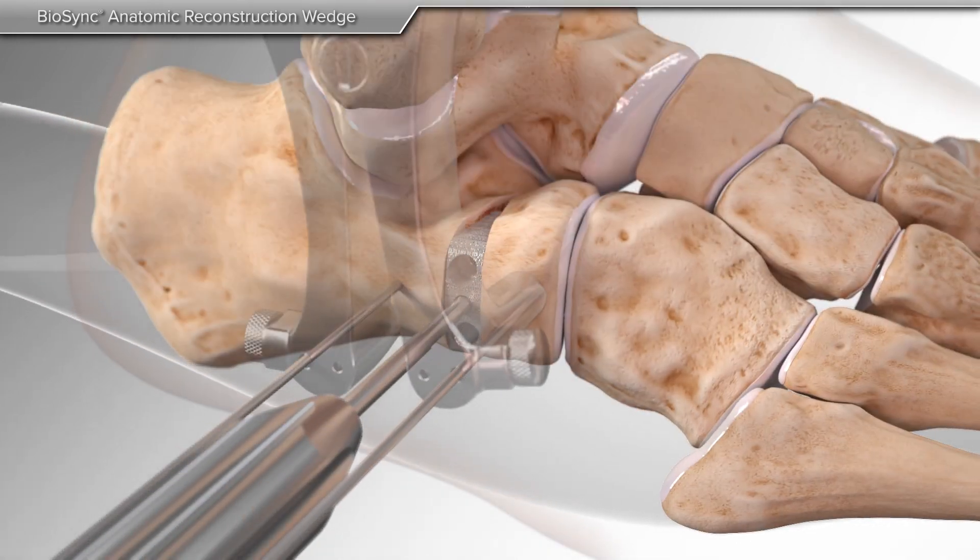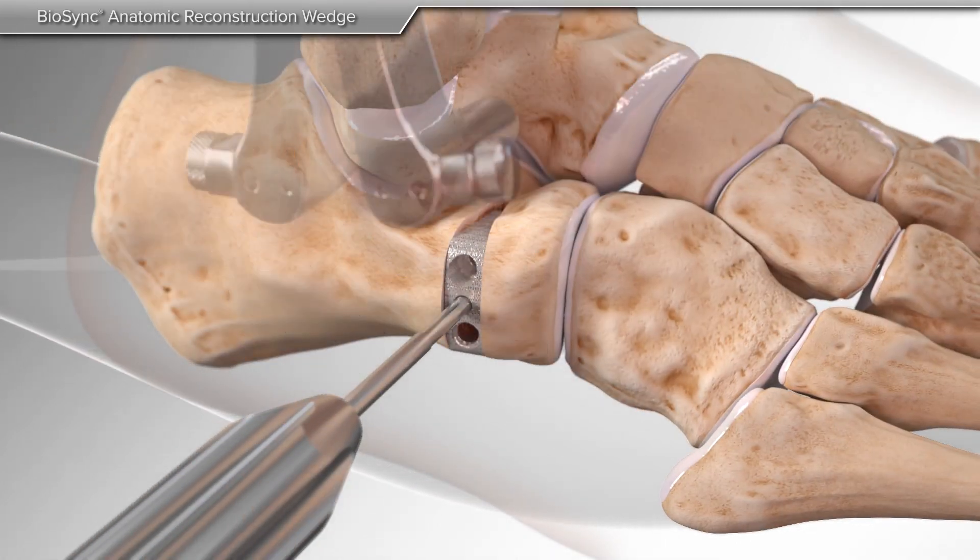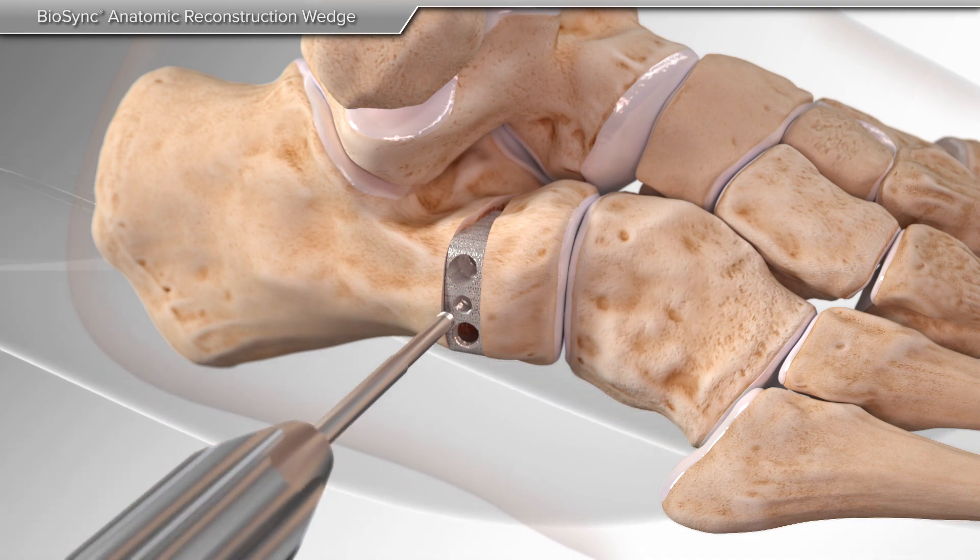After the Biosync wedge is inserted into place, the distractor, pins, and threaded handle are then removed.